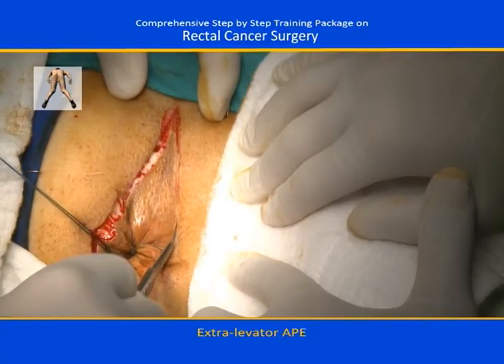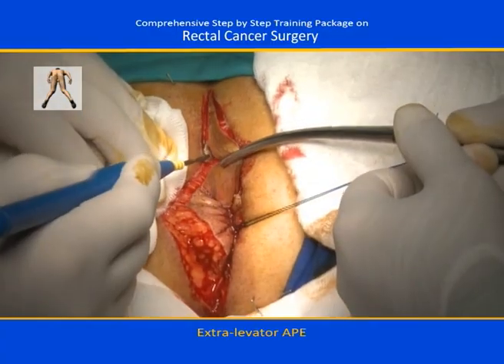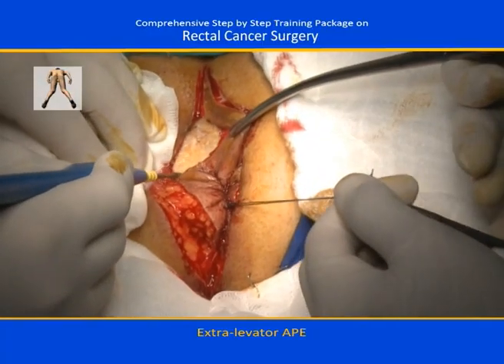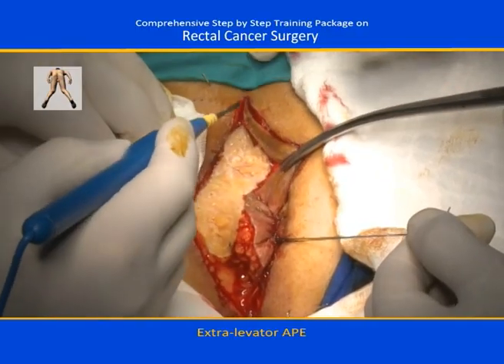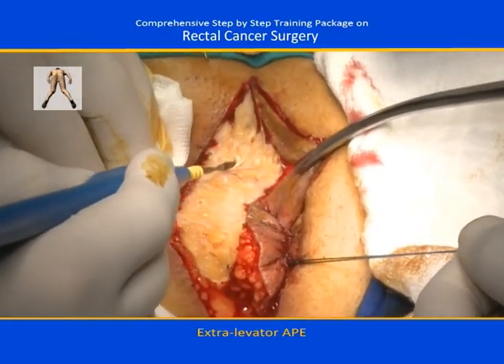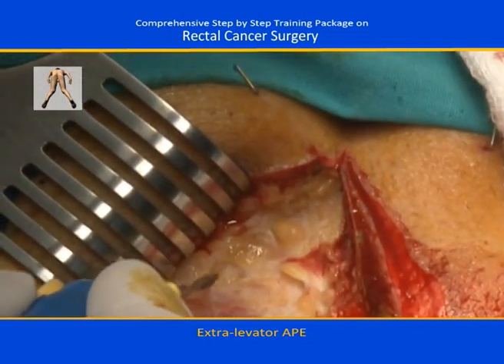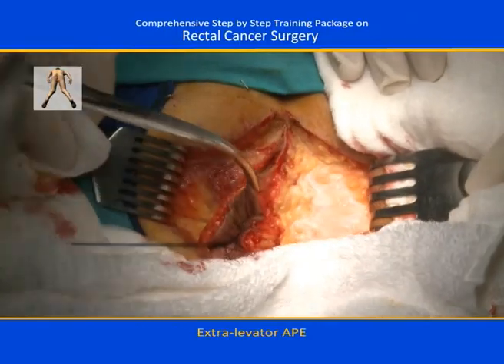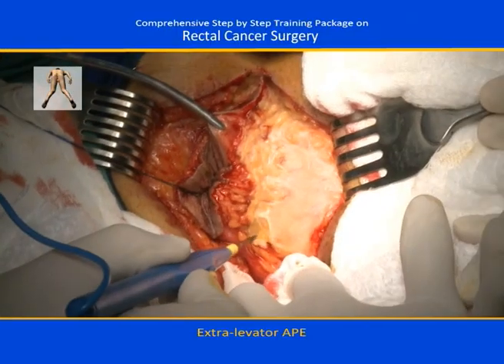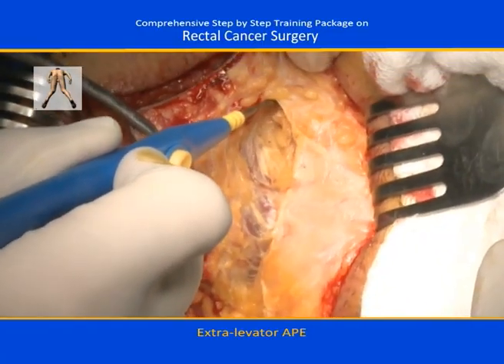Surgical incision from coccyx to perineal body is performed around the anus. Dissection is carried out just outside the external anal sphincter and then carried out between the ischioanal fat tissue and the levator muscles. There is no need to remove either a large skin area or ischioanal fat tissue unless the preoperative radiologic imaging shows invasion of these tissues.